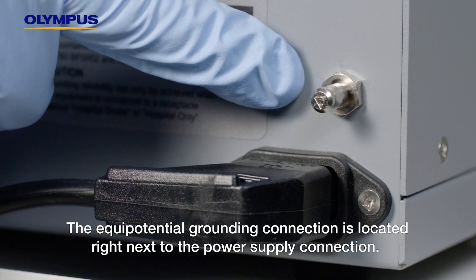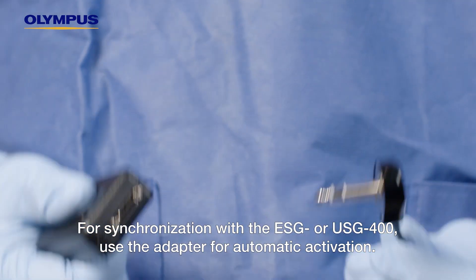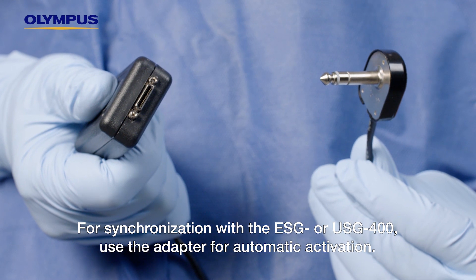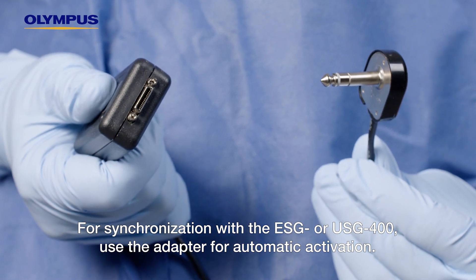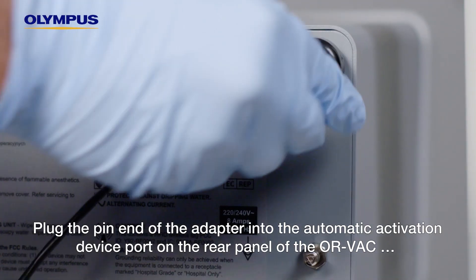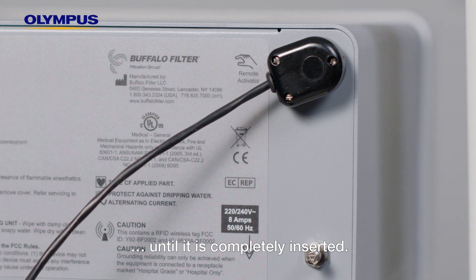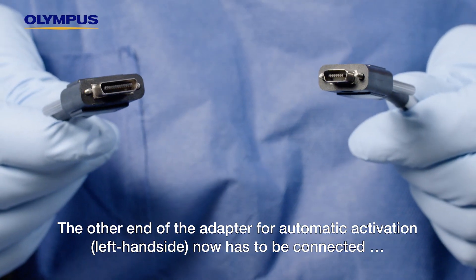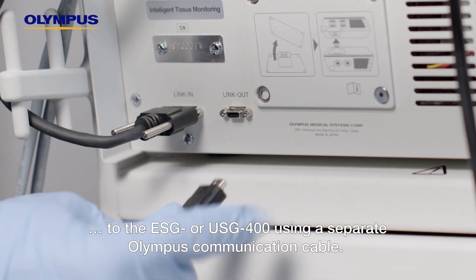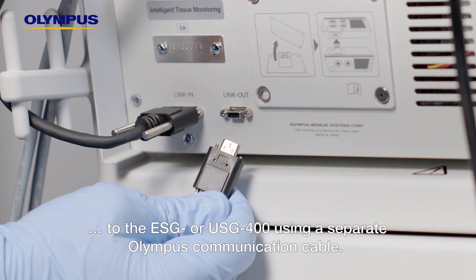The equipotential grounding connection is located right next to the power supply connection. For synchronization with the ESG or USG400, use the adapter for automatic activation. Plug the pin end of the adapter into the automatic activation device port on the rear panel of the ORVAC until it is completely inserted. The other end of the adapter for automatic activation now has to be connected to the ESG or USG400 using a separate Olympus communication cable.